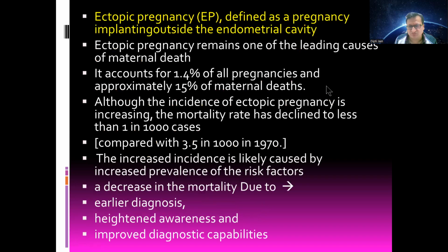So, ectopic pregnancy is defined as pregnancy implanted outside of the endometrial cavity. Ectopic pregnancy remains one of the leading causes of maternal death, and accounts for 1.4% of all pregnancies and 15% of maternal deaths.